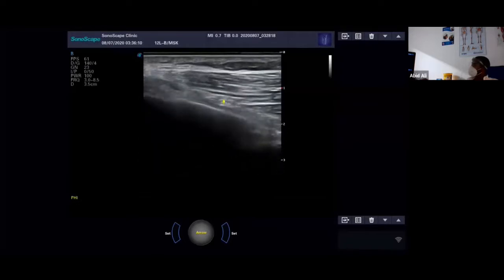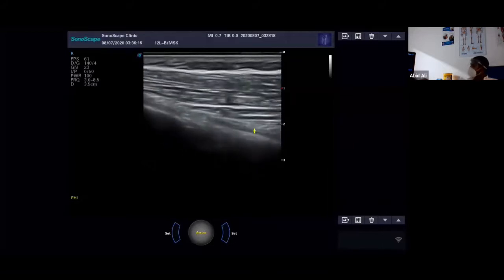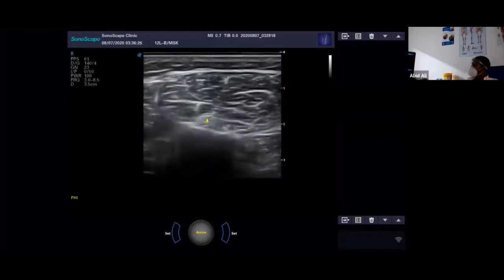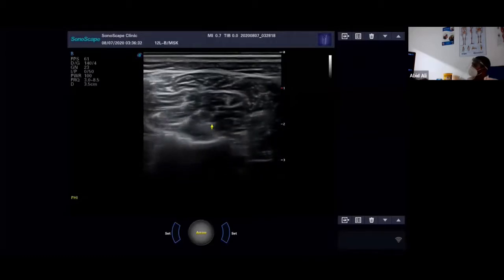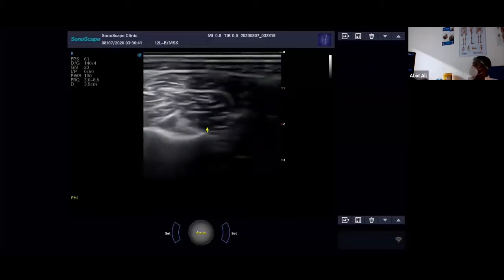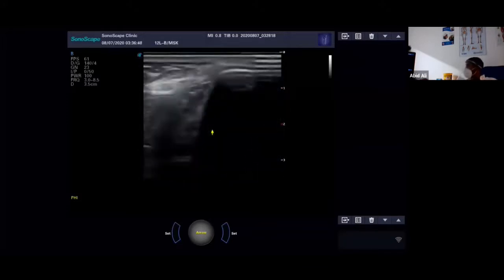Yeah, we were thinking about bringing a couple of drop foot patients and having a little look at the peroneal nerve, see what the difference is. And you can follow the nerve down. Because it's quite a nice and big nerve to see around the fib head. Just here. Yeah, see the little honeycomb appearance, little black dots. Yeah, I can bring my focus down. And that just helps follow the nerve down. And down into mid calf now. And that's pretty much what I do for a medial lateral knee.